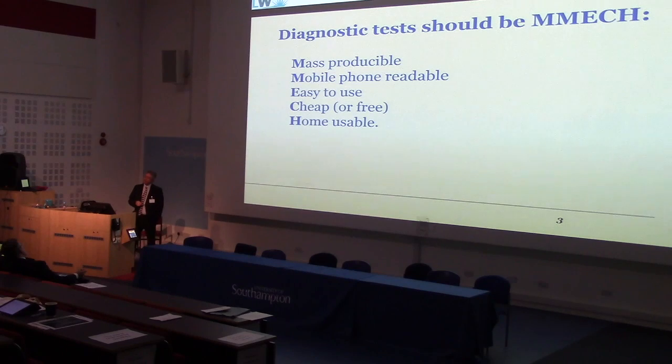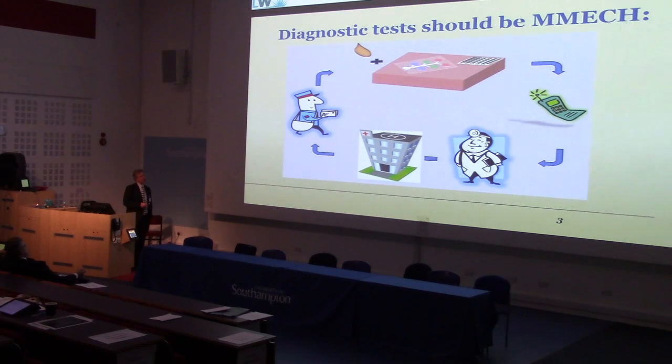Other things you might want to do: mass producible, certainly, mobile phone readable diagnostic, easy to use, certainly, cheap or ideally free, and home usable. So I'll show you some things we're using which can be used in the home as a diagnostic for detecting things. And this is the kind of cartoon here.